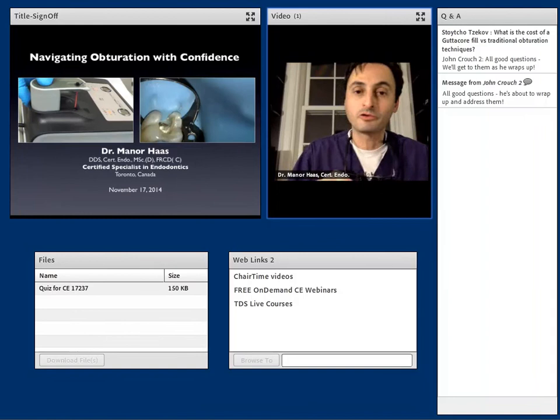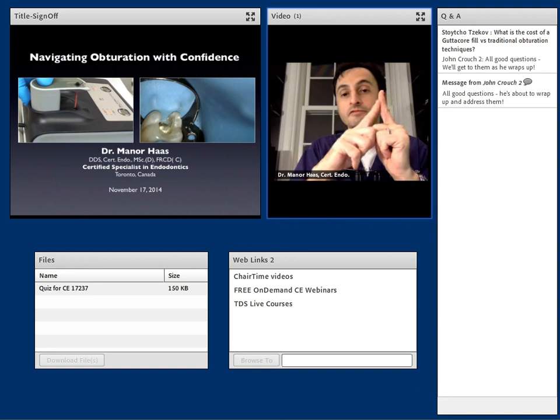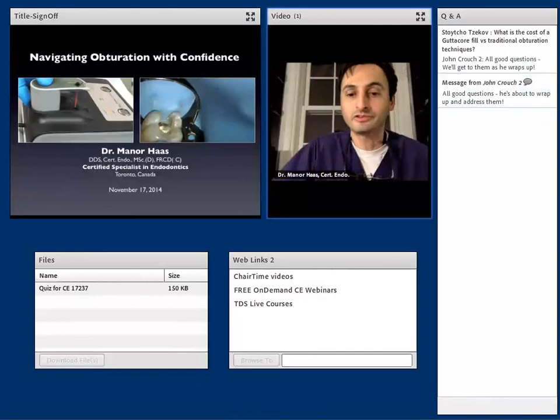With gutta core, the way it flows, if there's too much resistance, it'll just fill coronally. So in other words, let's say you have a canal that merges apically. You filled one canal, and now this one needs to go in there. Well, it's going to meet resistance right at this point, and it's not going to go further. A plastic carrier may have gone further, and now you're pushing stuff out the apex. Gutta core, when it meets resistance, even though you keep pressing apically, is going to extrude coronally, which is brilliant because now you have a much reduced chance of extrusions and all those unwanted accidents.